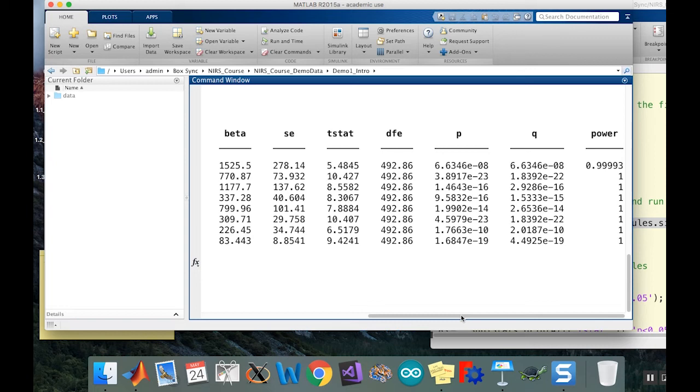But that's the p-value, so if I'm 10 standard deviations away, I'm significant at 10 to the 23rd, fictitious data. But then this is the Benjamini-Hochberg corrected version. And then this is the power, which is described in the Toolbox paper that just came out that has all the equations for the power. But I can never remember the equations for the power.